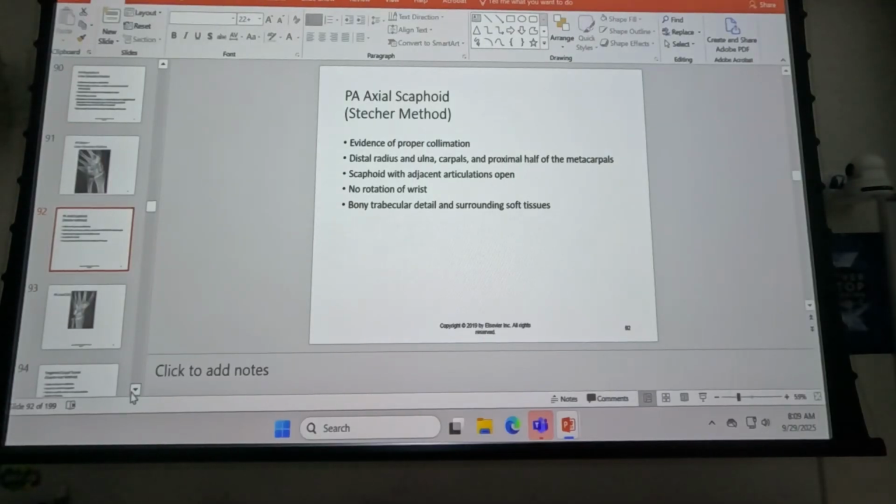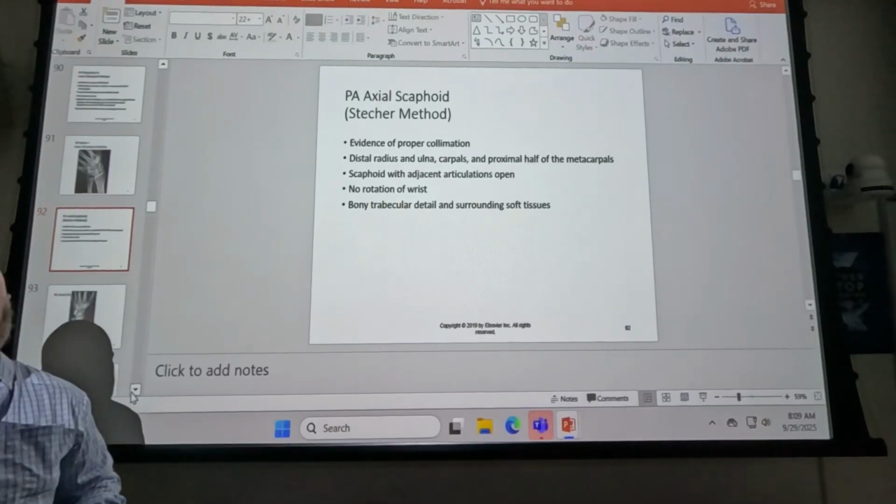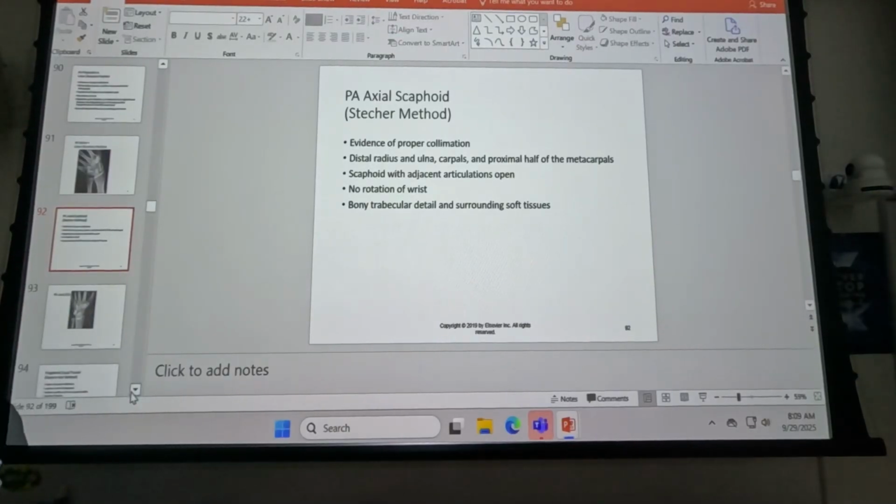So, and this is just clinical correlation here, the textbook answer is the test question answer, so it'd be 2.5 inches. But your clinical correlation there is if you've already done the PA, oblique, and the lateral wrist, you can collimate this thing down to almost nothing in both cases, right? So a little bitty area of collimation, your central ray should be to the scaphoid.